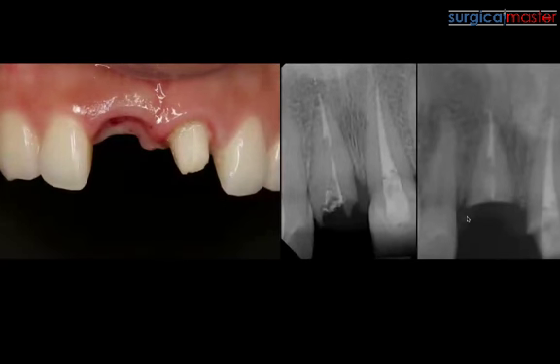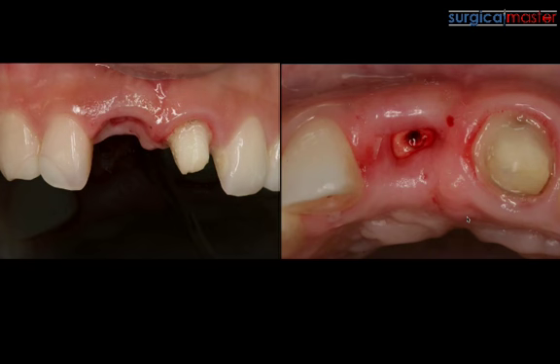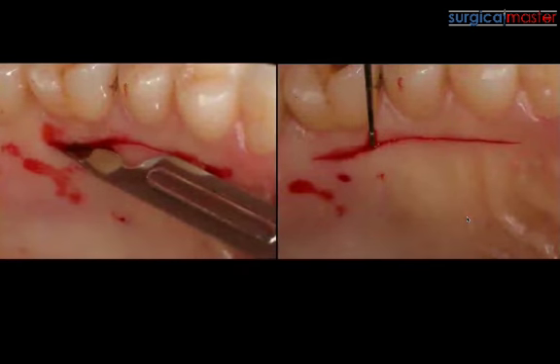Okay, so what's the reason we are grinding the tooth down at bone level? And why am I complicating my life in terms of the extraction? Because what happens when you grind the tooth down? The soft tissue is going to cover, and that's free. The human body will heal itself. You'll get some additional coverage if you grind it down all the way subosseous. You will get complete coverage. You'll gain a few more millimeters of tissue. And that's just a nice way to manipulate normal healing processes and gain more tissue for your future implant site. So I did that. And only after that, I extracted the tooth.